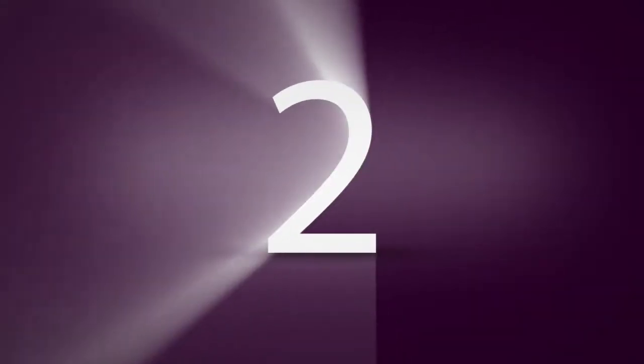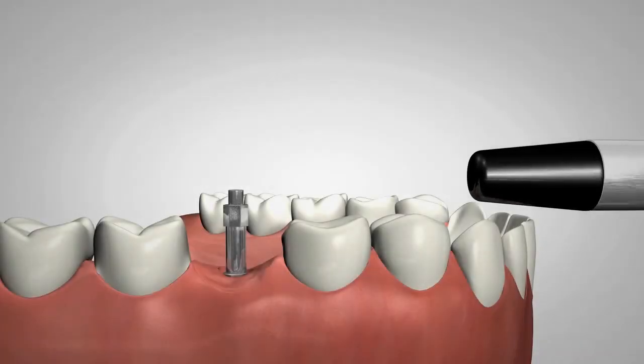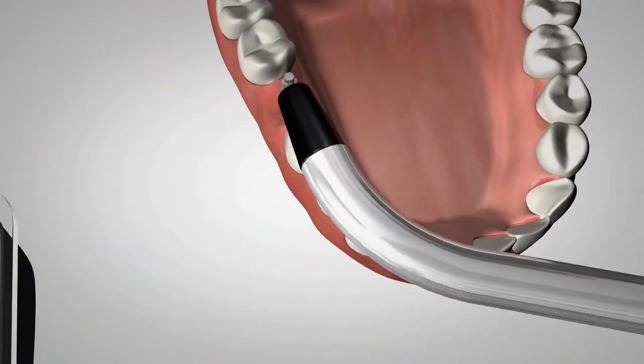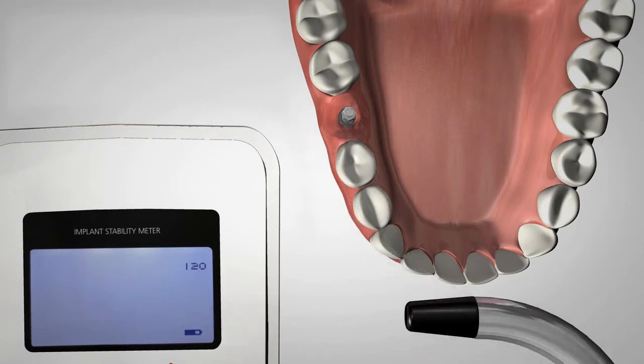After mounting the SmartPeg on the implant, the first chair-side reading is taken. An ISQ value is generated and shown on the display. It reflects the level of stability on the universal ISQ scale, from 1 to 100.